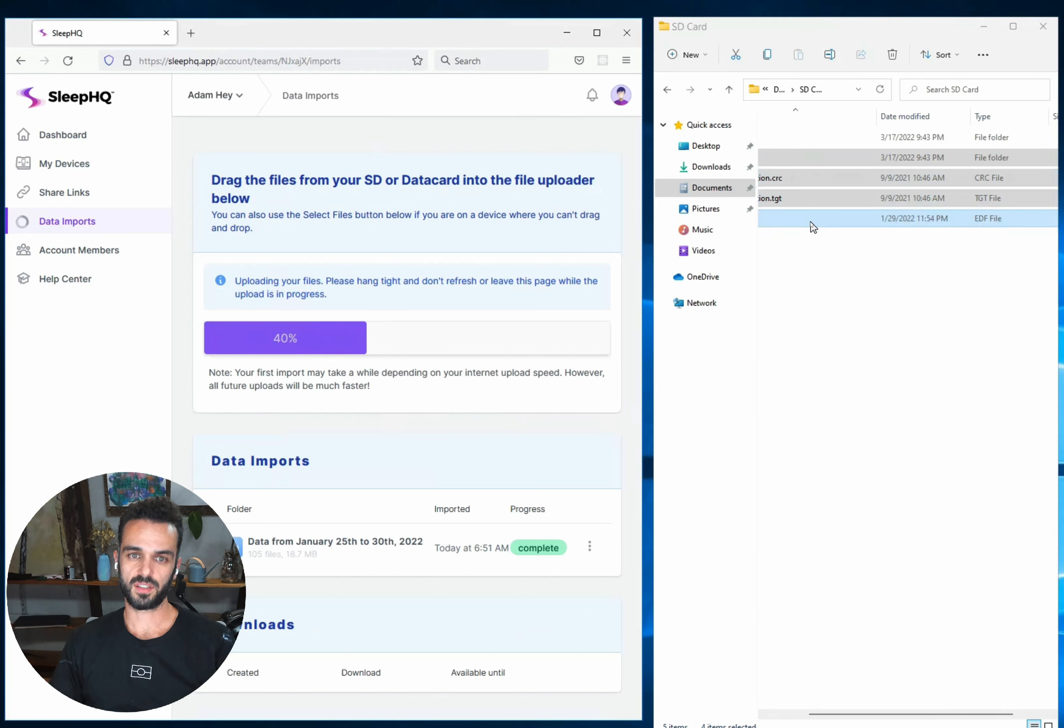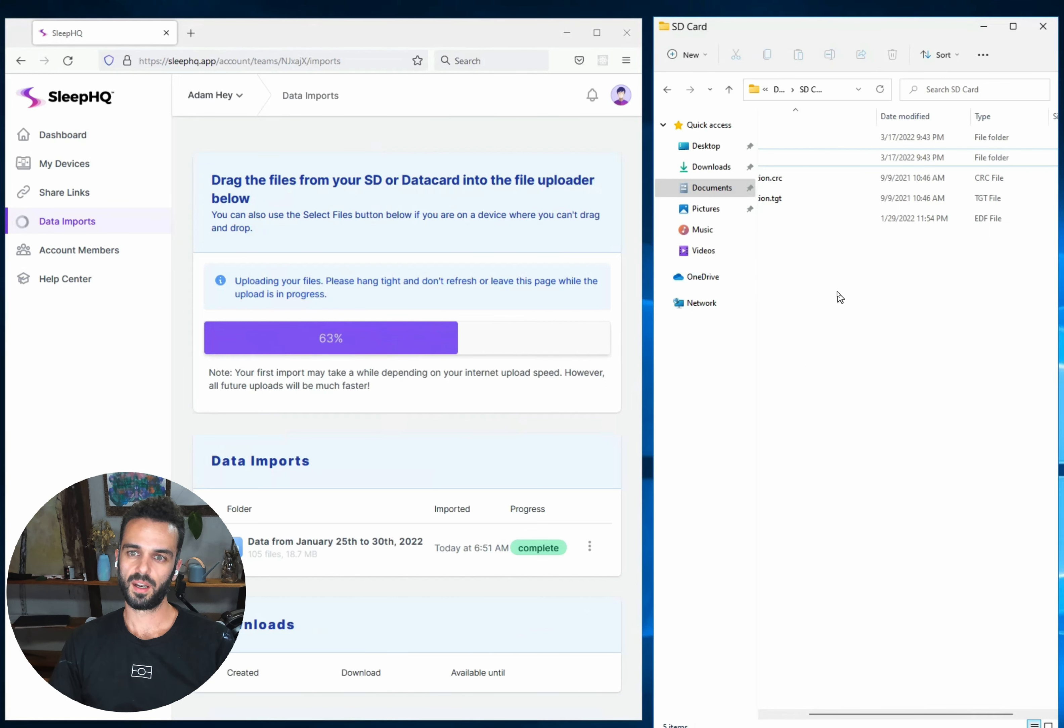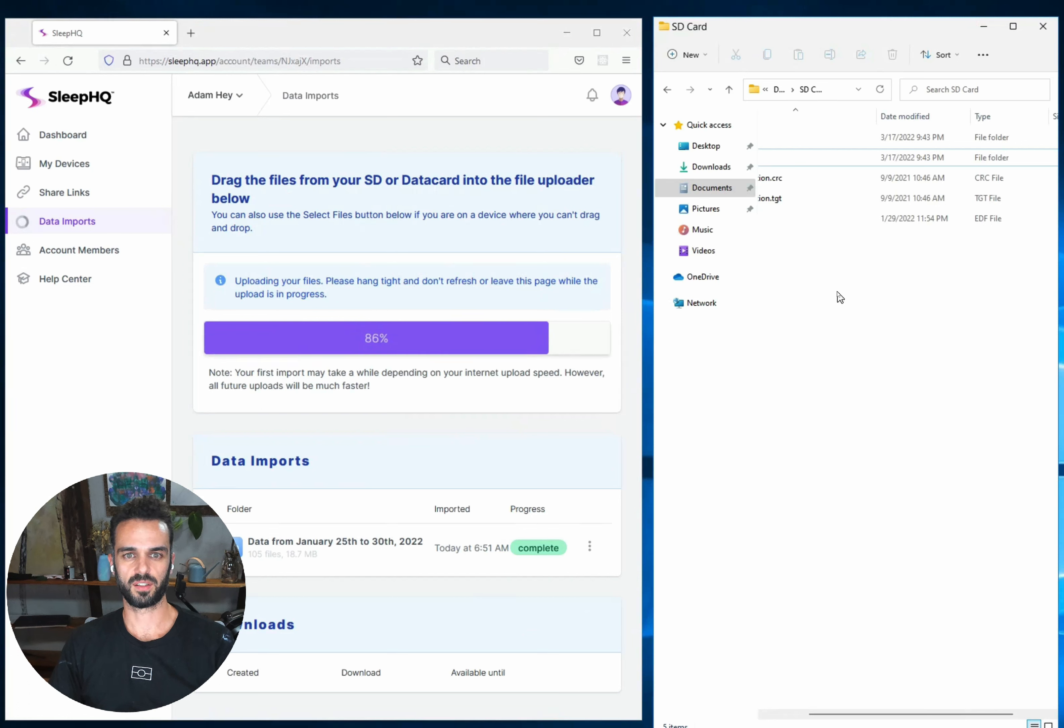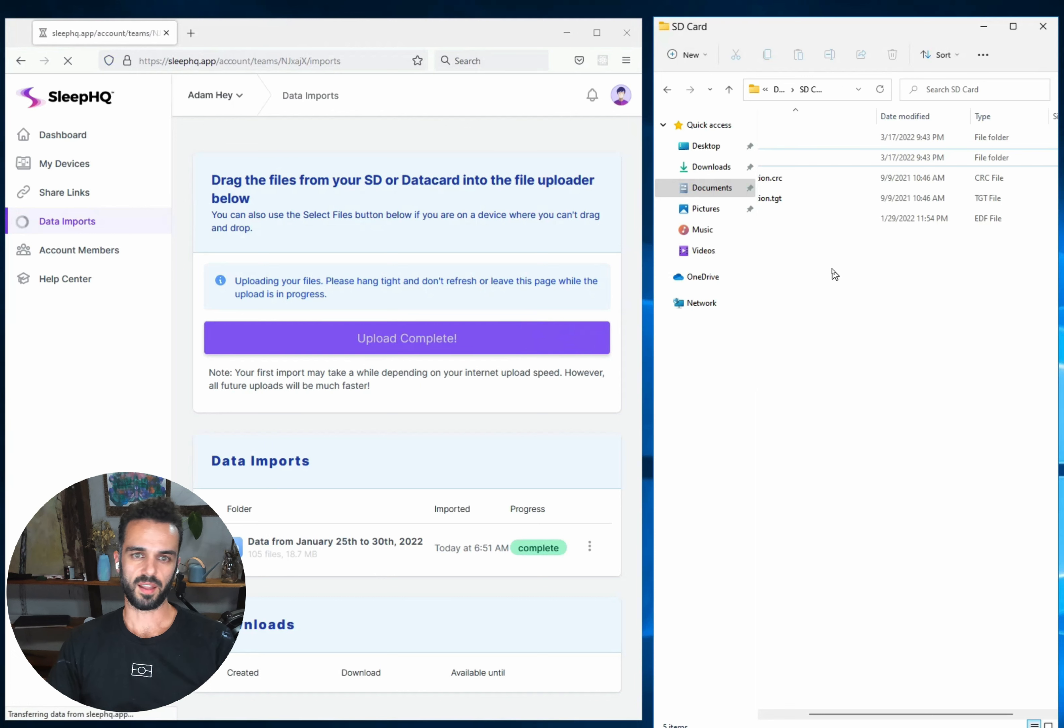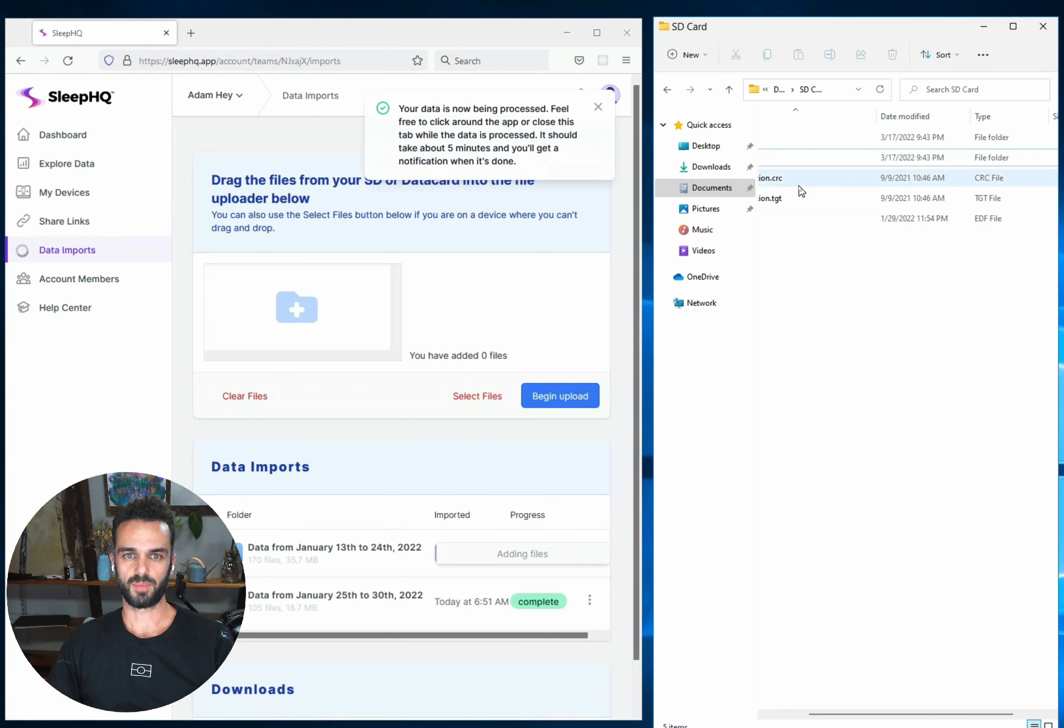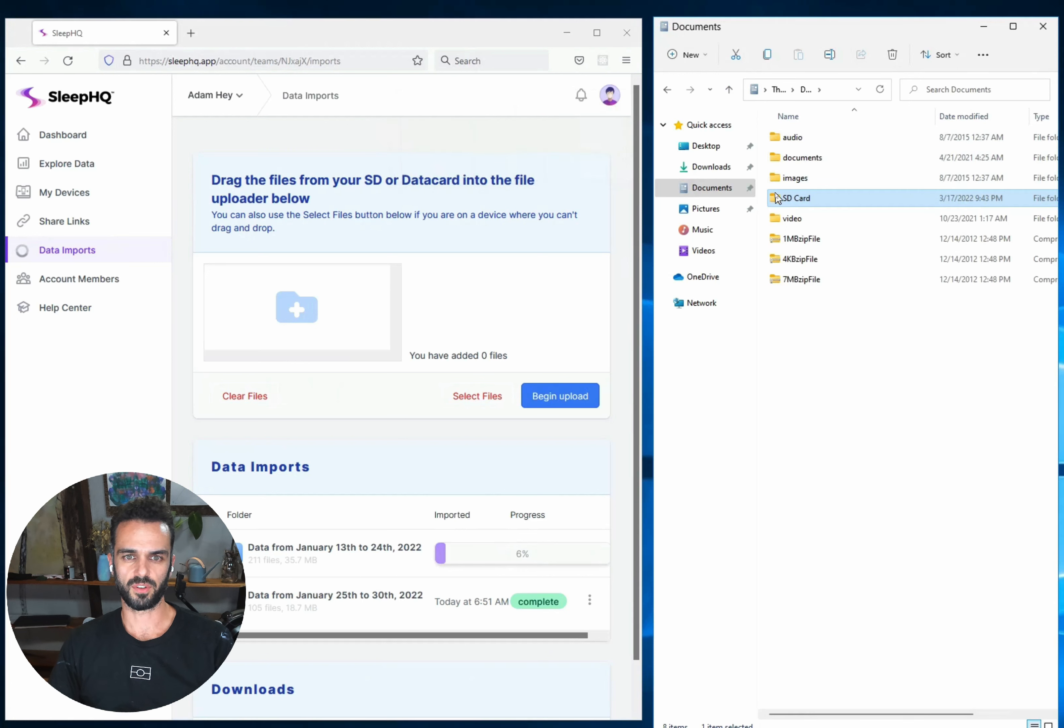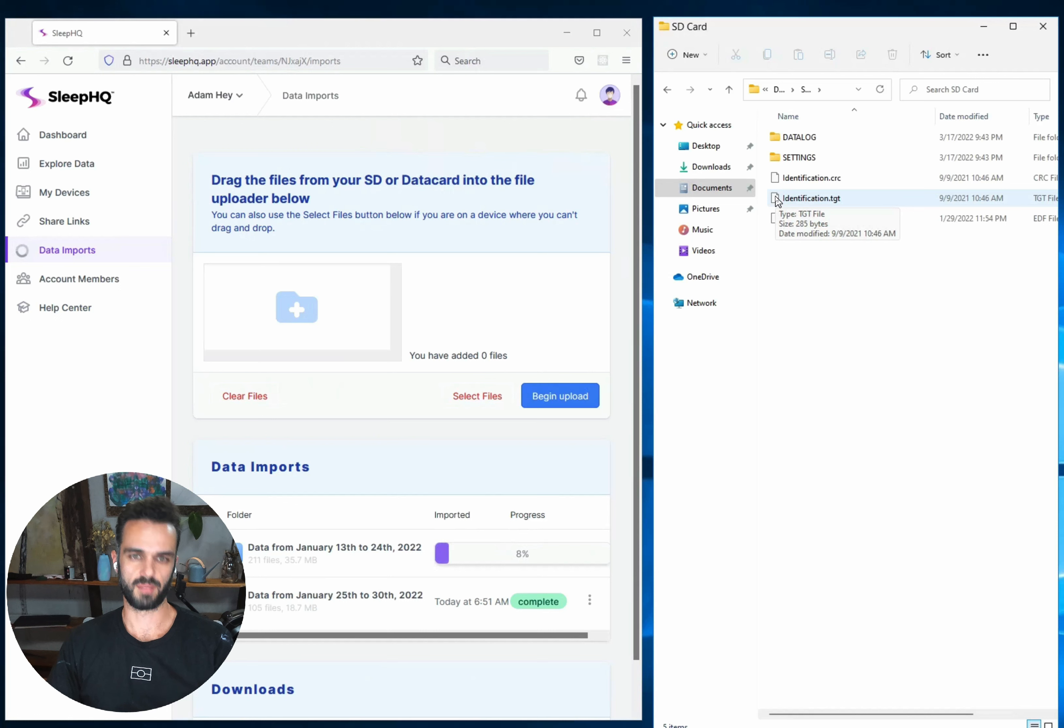So the things to watch out for here, don't try and drag the entire SD card itself across into the uploader, because that will fail. It seems to just make windows hang and it just doesn't work very well. So don't do that. Make sure you're selecting the actual contents of the SD card instead. The other thing to make sure you're doing is just selecting chunks of files at a time, especially if you've tried and you've had some issues with uploading, just use smaller chunks and then that's going to be the most successful way to do it.